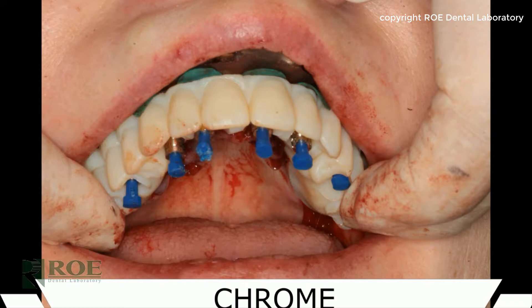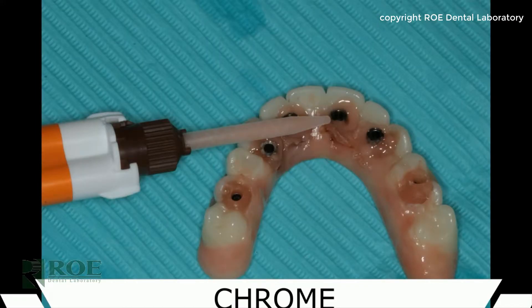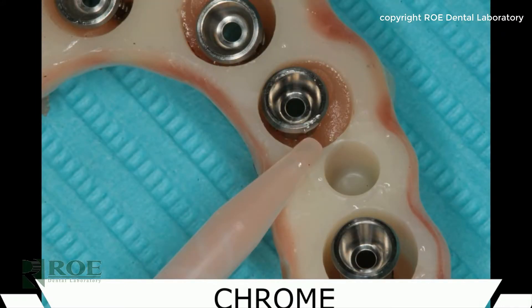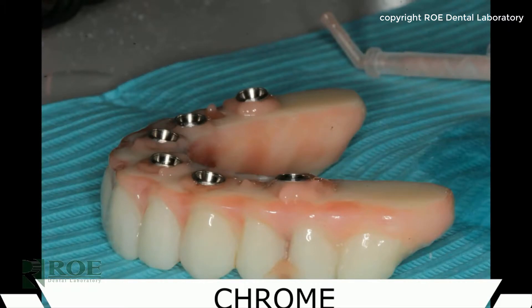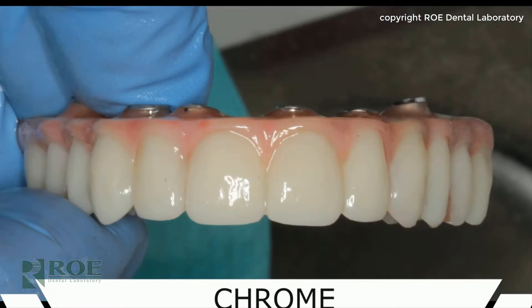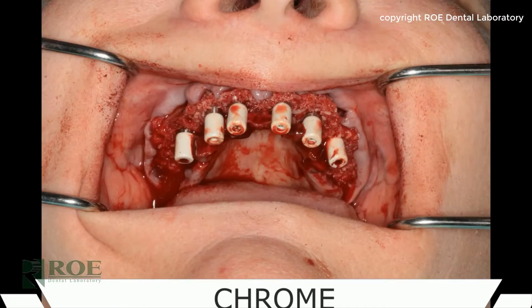Once that's complete, the prosthetic is removed and a second pickup is completed with the rapid appliance. The rapid appliance is used for the final conversion of the prosthetic. Once the prosthetic is removed, it goes back into the laboratory at the doctor's office. There are voids to be filled and holes where the prosthetic fits to the carrier guide, and the conversion process takes about 10 to 50 minutes.